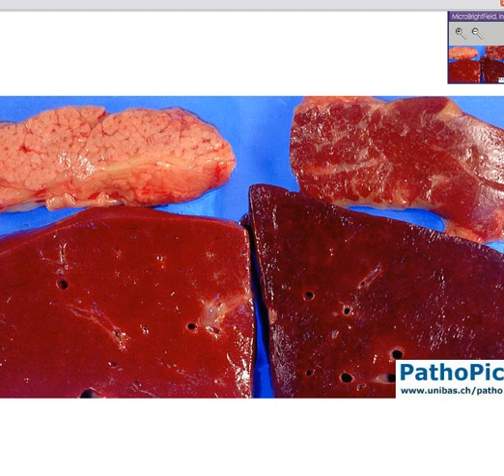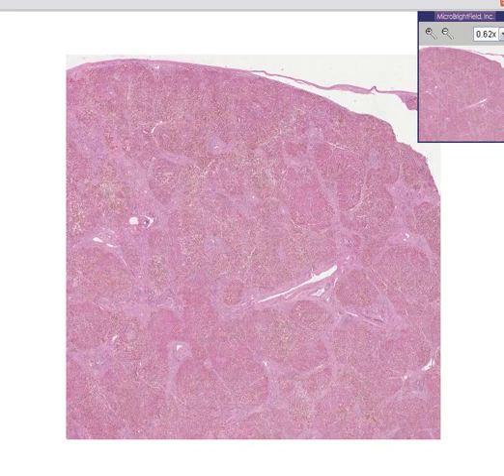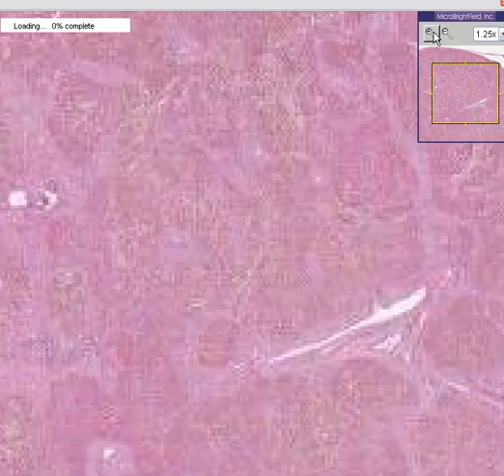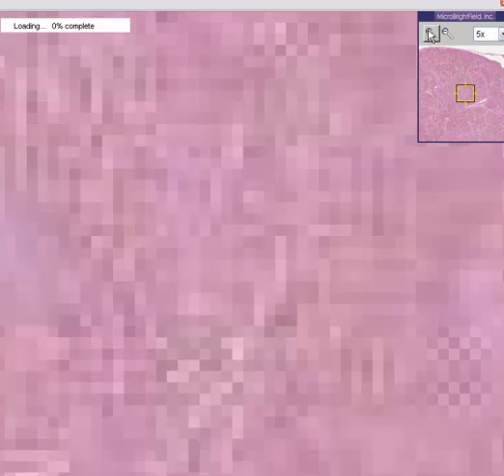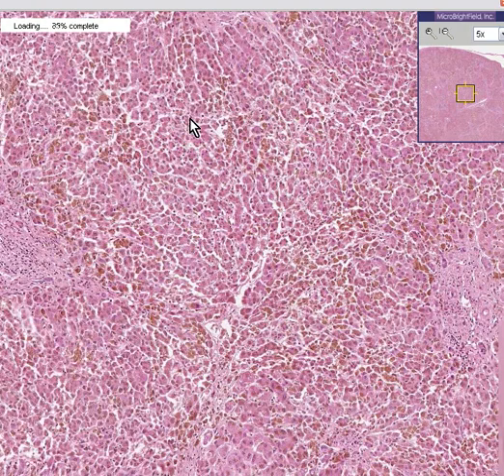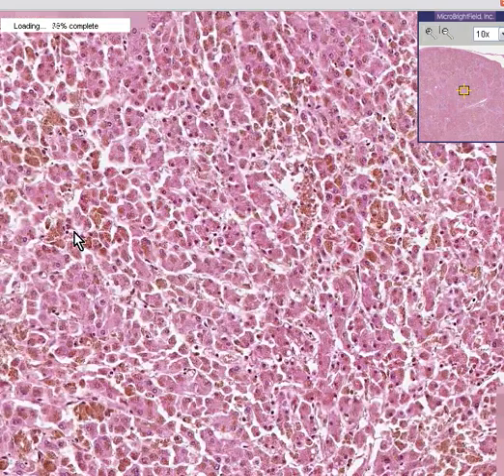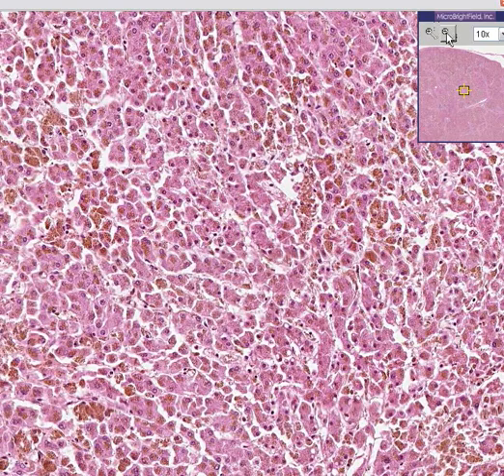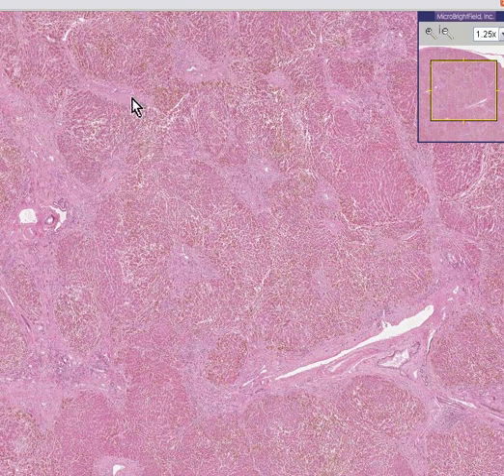And why is it browner than it should be? Well, in the case of the liver, it's browner because when you cut through it, you could see that all, if not most or many, of these hepatocytes are just loaded with iron or hemosiderin form of iron. I think you can also agree that there's a lot of irregular bands of fibrous tissue between these nodules.